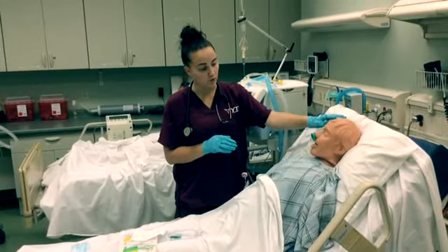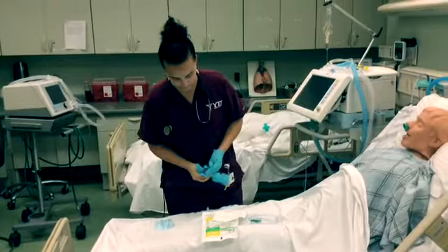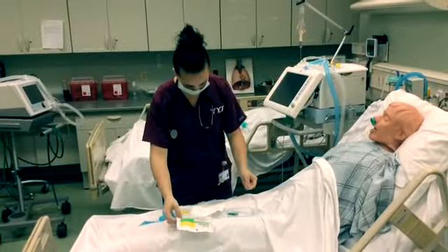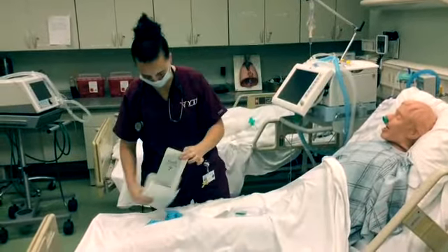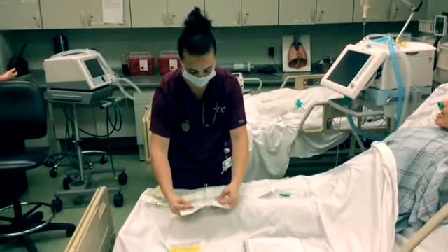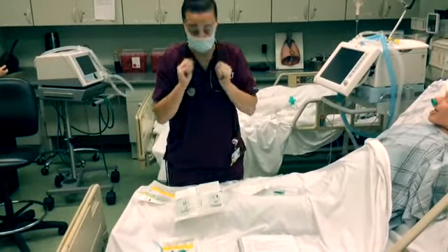And we use it to help protect the nasal mucosa. These are your sterile gloves. Once you open this and touch, you cannot use your hand. They are sterile.